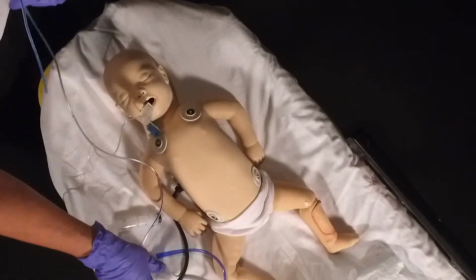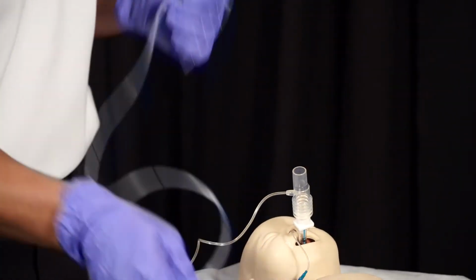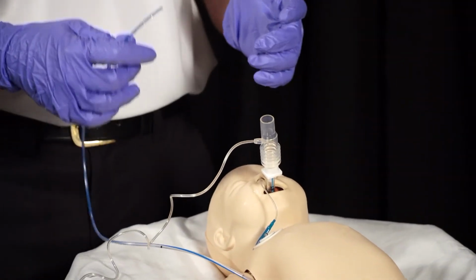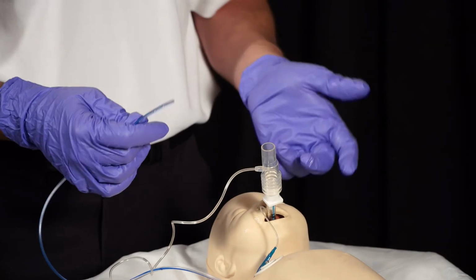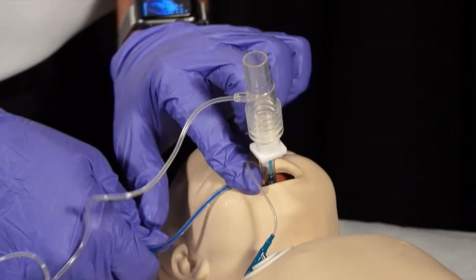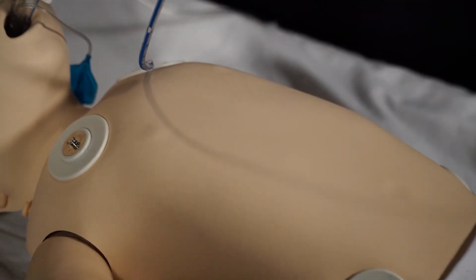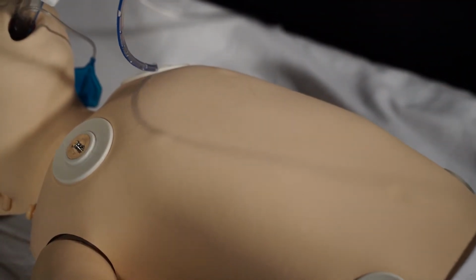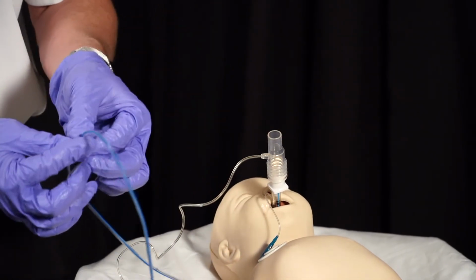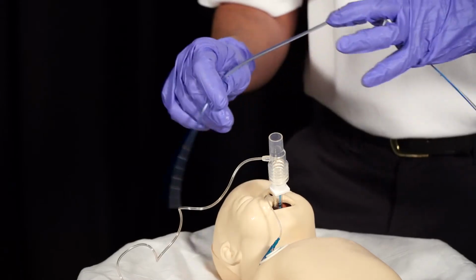So the gastric tube comes in the package like we stated earlier. We're going to measure this. It depends on which textbook you read; there are multiple different ways of measuring it. I'm just going to show you the standard way. You're going to go from the patient's mouth to the patient's ear, and then measure down to the xiphoid process. After you do that, you're going to mark exactly where you want the gastric tube to go down, the appropriate depth.